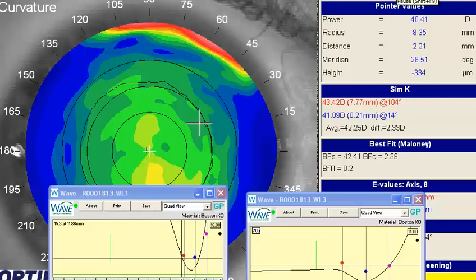Refracting wave support. I see from your clinical request you're struggling with this design in two basic areas. The first being the fit. There seems to be some difficulty with scleral compression and some adherence of the lenses. Secondly, you're getting some unanticipated, unexpected overrefractions with some weird cylinders.